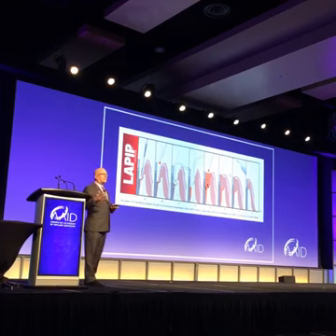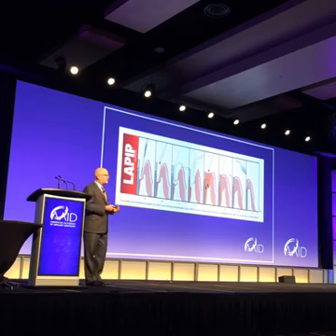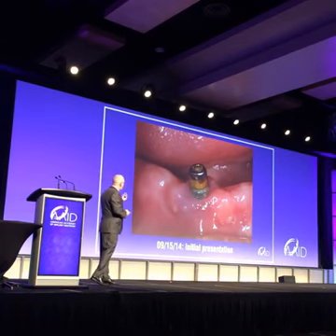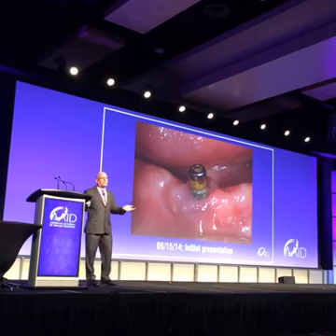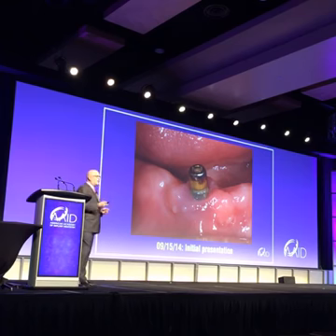Then we use the laser again to develop our fibrin clot. And then we adjust the occlusion, just like you would do for any case. So here are my cases now again. Here's one initial presentation. A lady came in, doesn't believe that these are not natural teeth, so she doesn't have to brush them. Well, now she's got inflammation all around the implant. Well, that's a problem. So we went ahead and treated her.